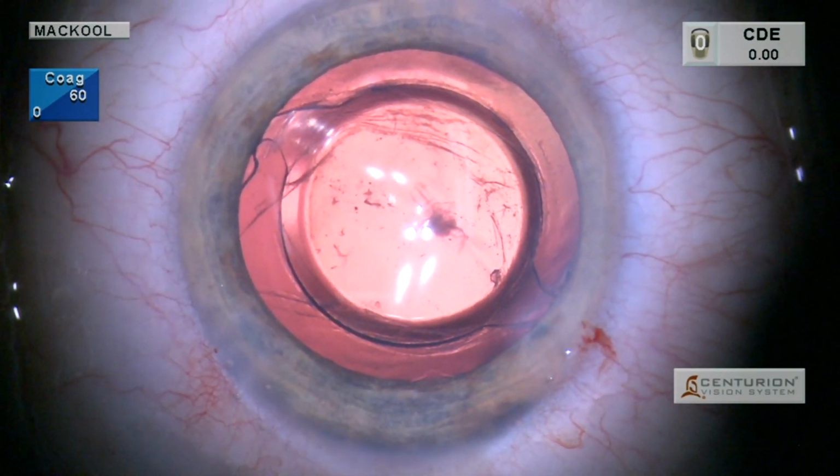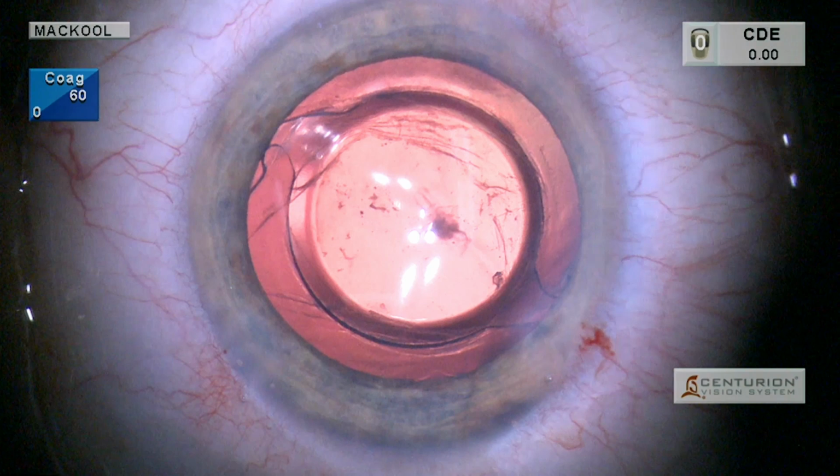And now in this final view we can see that both the nasal and temporal aspects of the optic have been captured anterior to the anterior capsule, and it now would remain only for us to carefully irrigate the OVD out of the anterior chamber without pushing the optic back behind the anterior capsule as we do so.